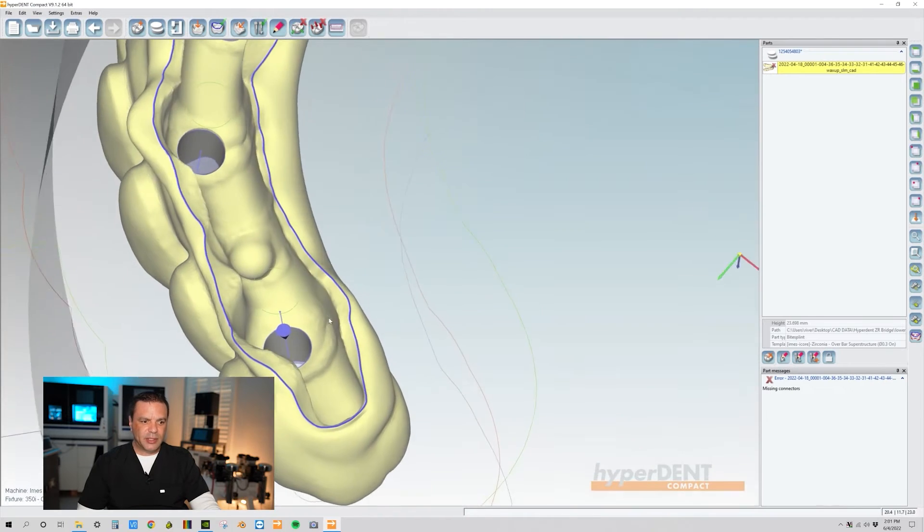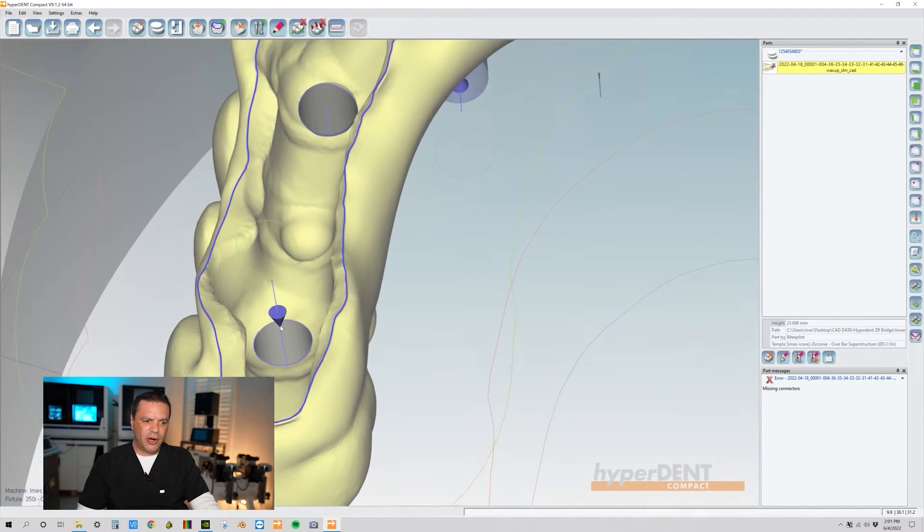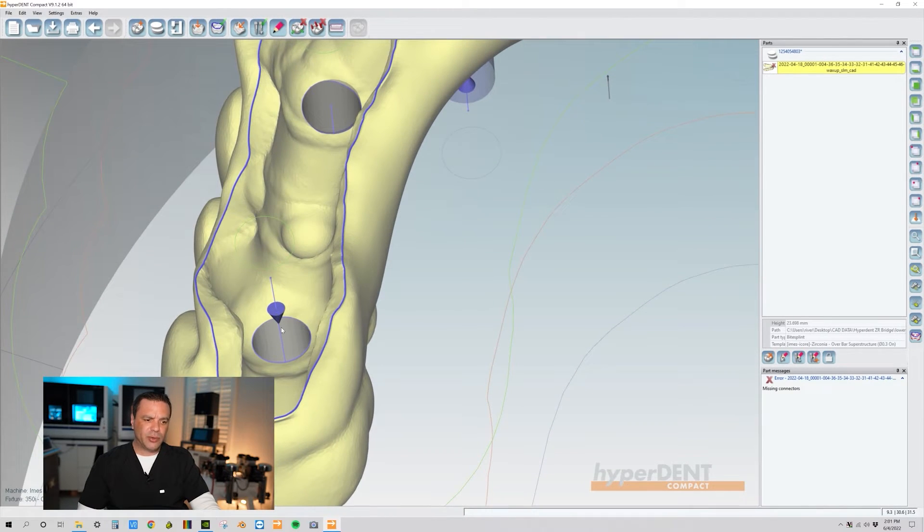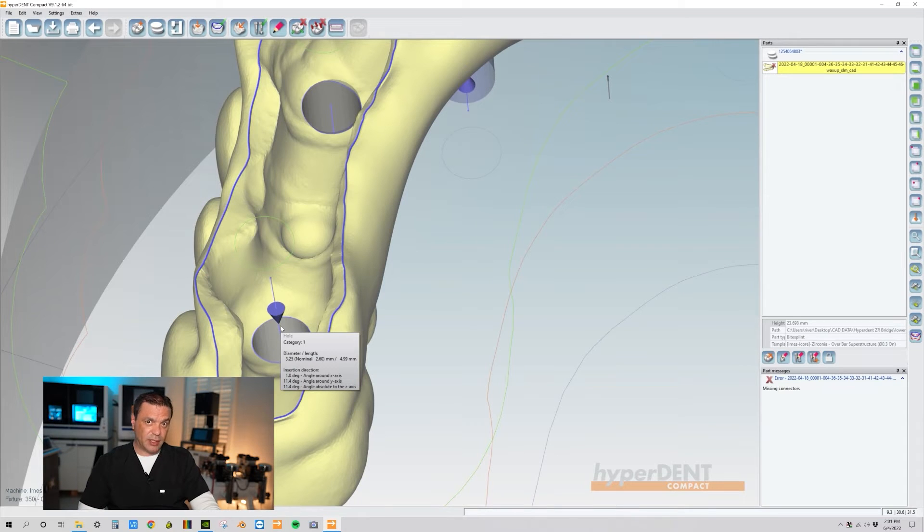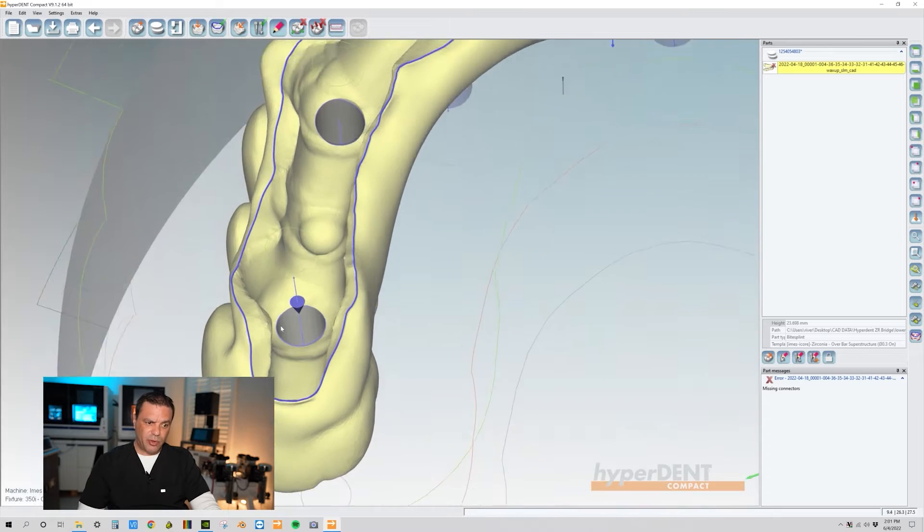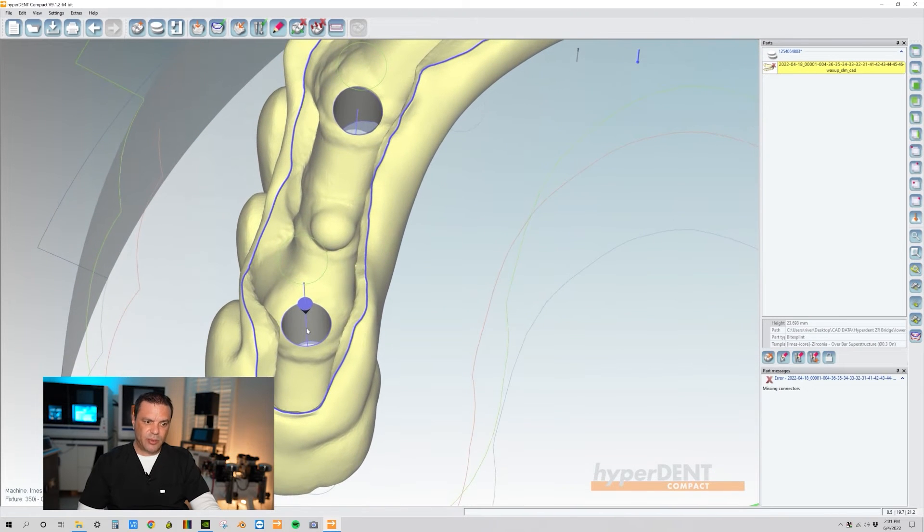All right, so this is actually the arrow is pointing towards the occlusal side. So if we run this we're going to actually run into some errors. So I'm going to save you guys a ton of time with calculations. I'm going to show you a real fast easy way.